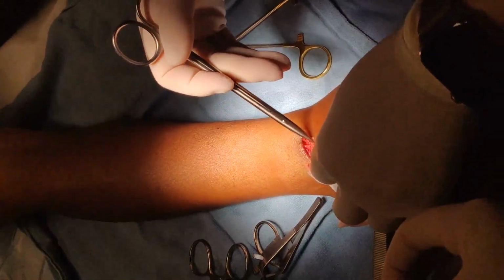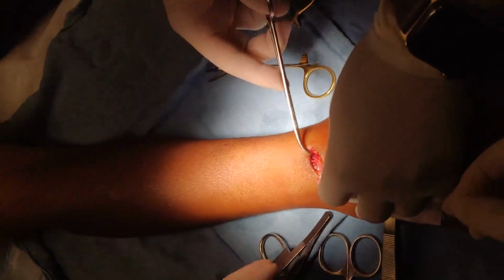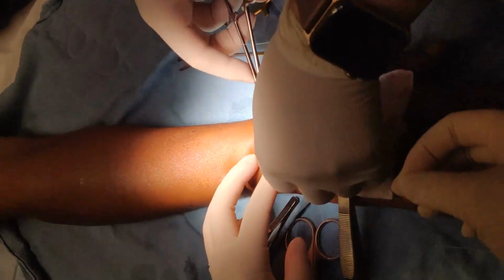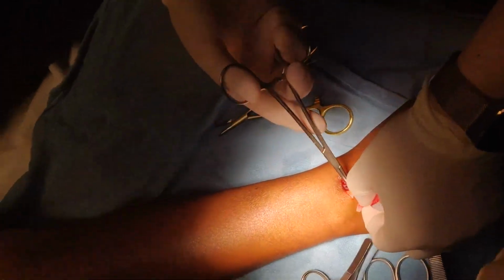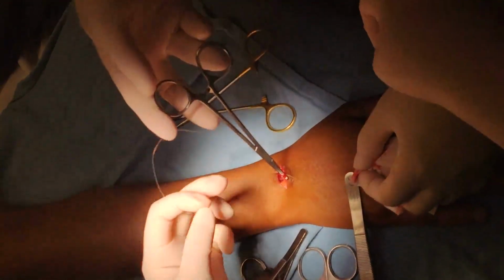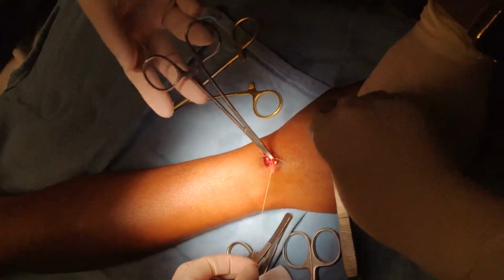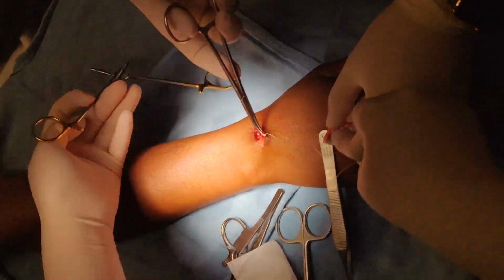Then, a tourniquet is used to stop blood flow so that the doctor can see clearly during the procedure. The doctor then performs the operation by dissecting the cyst carefully. The tourniquet is then released before closing the wound to ensure that no major blood vessels were affected. The doctor wants to ensure that the area operated on will be stable after suturing. Finally, the area is closed.